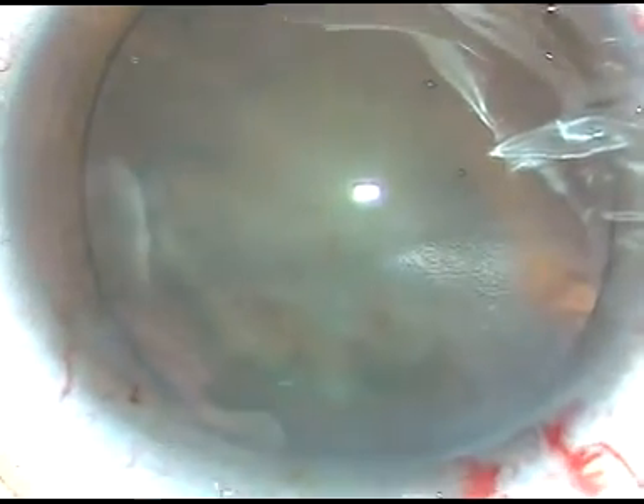I know that in this case it will not be possible to chop the nucleus. I have to manage this case in some other ways. By this time, the main incision and two side ports have been made. Now I am going to incise the anterior capsule with the 26-gauge bent cystotome that I made at the beginning of the surgery.